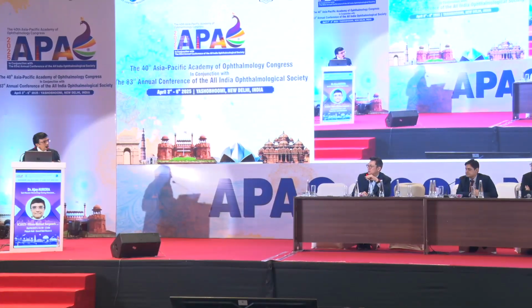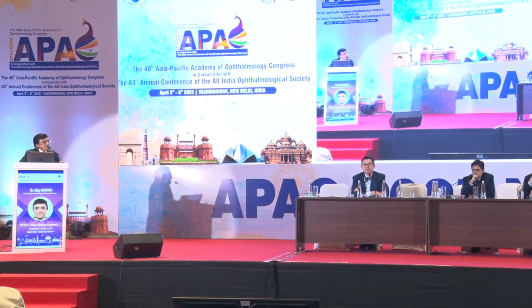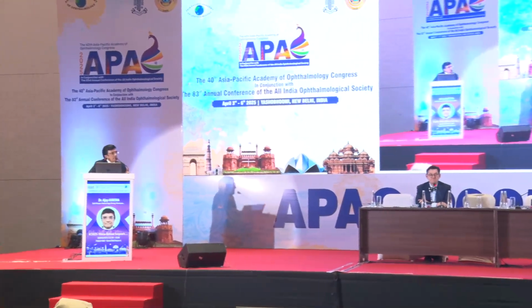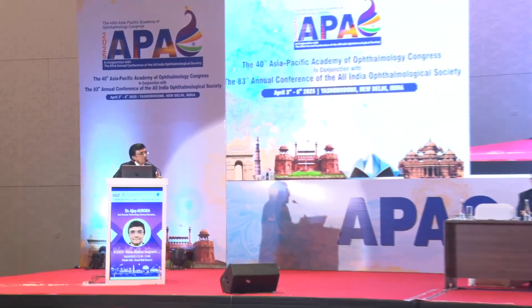Do you think that the gauge is important now? You know, we're headed now to doing 27 gauge, and I think we will see this in the next 1 to 2 years. We'll probably move that way. Do you think we'll have less of these problems, or we can manage them better? So I think that's very true. See, the problem we face in India is reuse of our instruments. So when we have 27 gauge, it's very difficult to reuse them.